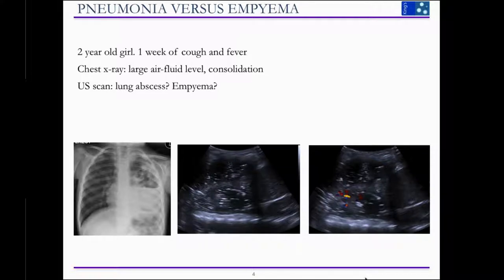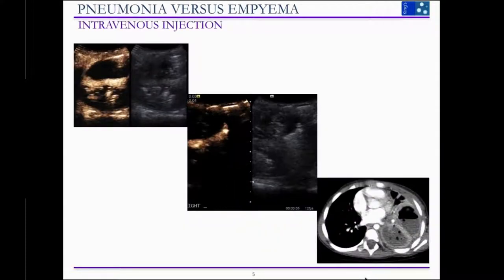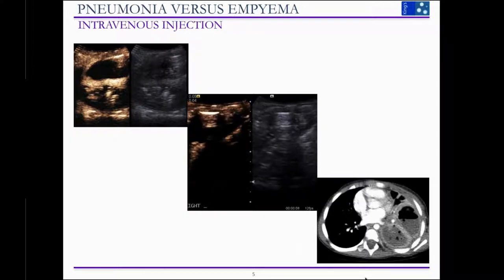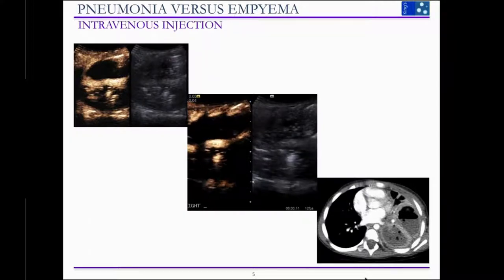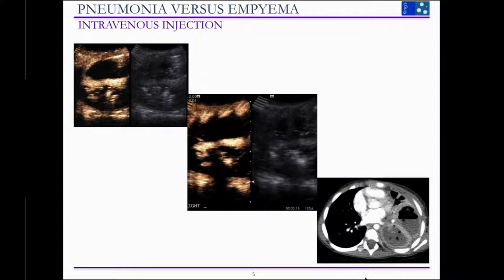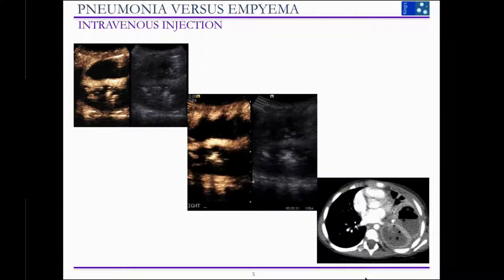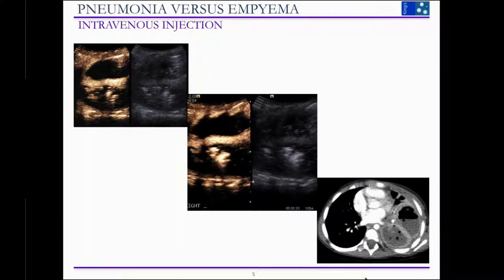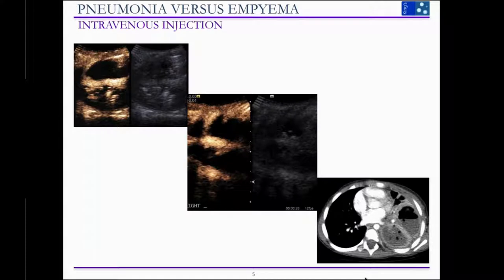On the middle and right-hand screen you have a heterogeneous septated appearance to the left lung with air within it — which could be coming from the pleural space or the lung — and color Doppler doesn't add much further to the diagnosis. After administering an IV injection of SonoVue, it clearly delineates your more superficially lying empyema, and deep to that your necrotic lung — necrotizing pneumonia — with vascularity running through it.